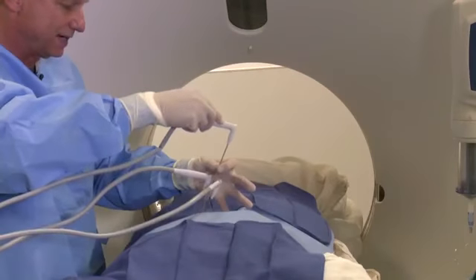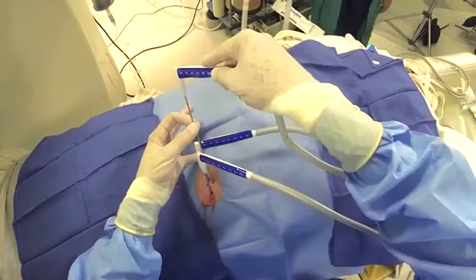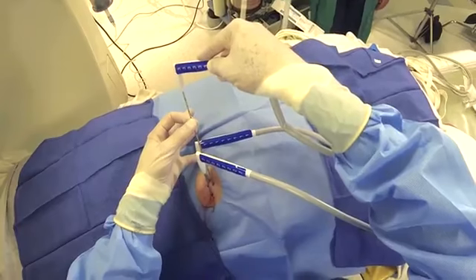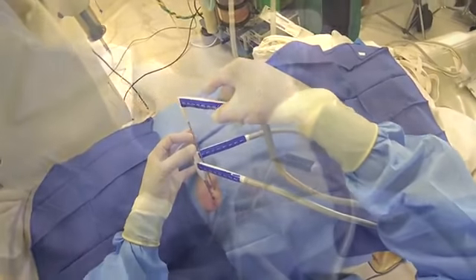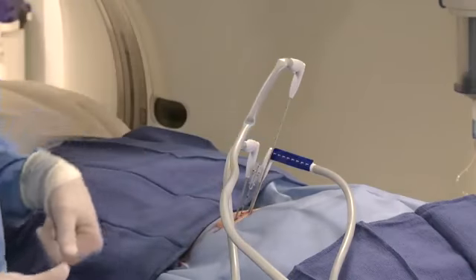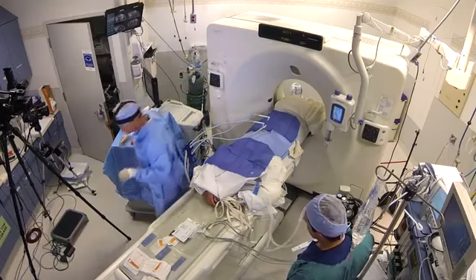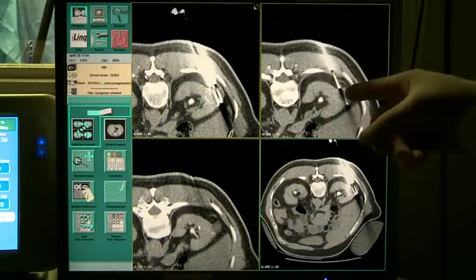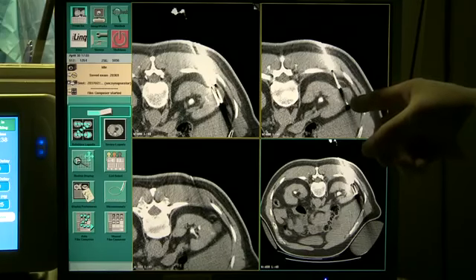So I'll pull it back, tip it quite a bit lateral, slightly higher, and then re-advance. And that looks like it caught in that more lateral projection, but we'll have to take the pictures to find out. So this is ideal. I'll tip it slightly more lateral, but all we really need to do is advance it.